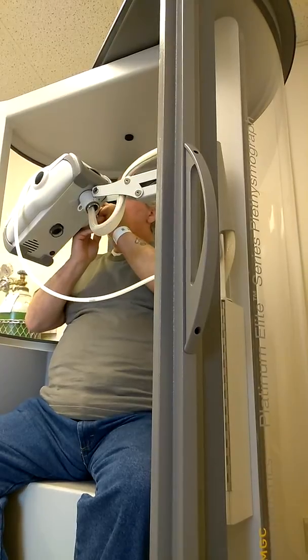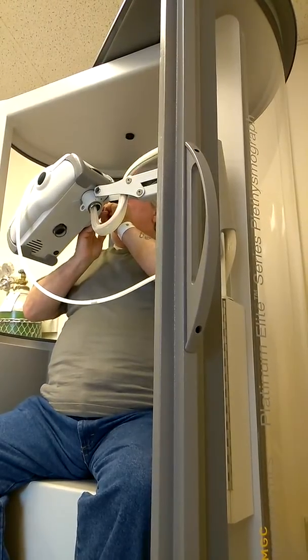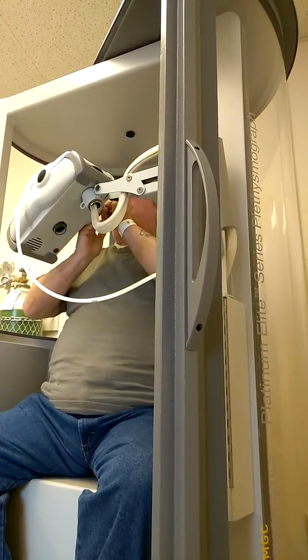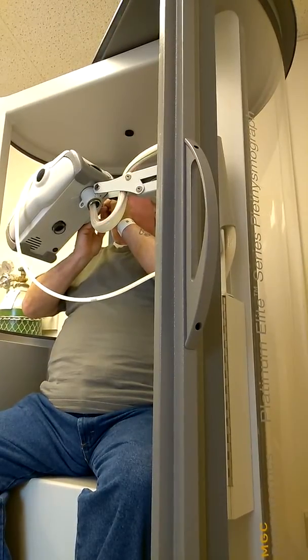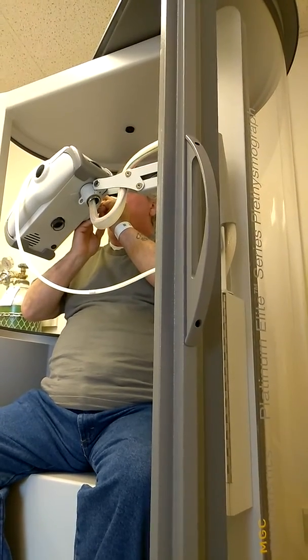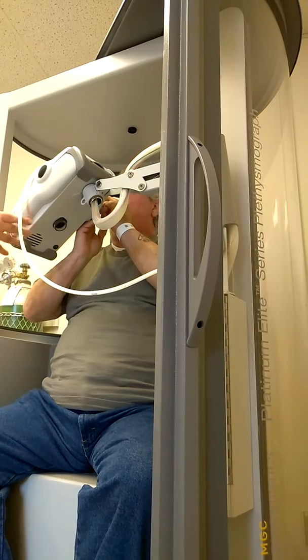Big breath. Good hold. Steady hold. Looks great. You're at five, and four, and three, and two, and one. Blow, blow, blow, blow, blow. Good push, good push. Steady out, steady out. Looks good. Come off that machine. Catch your breath. Take those nose clips off. Good.